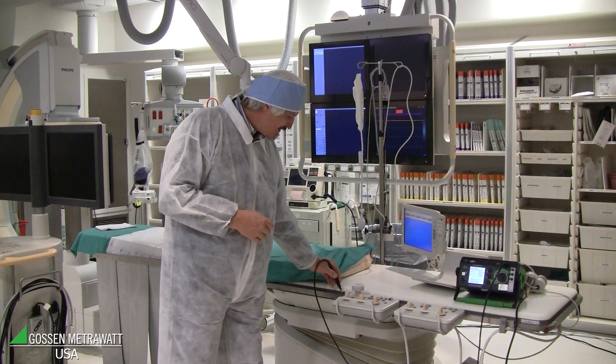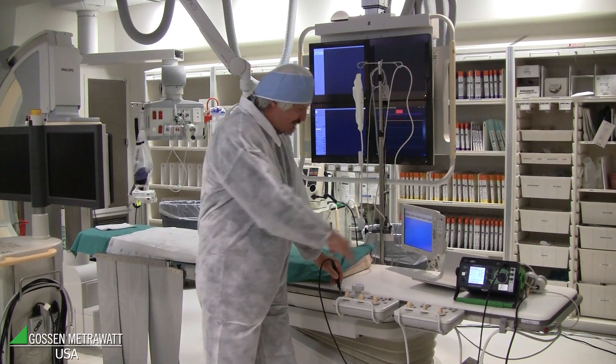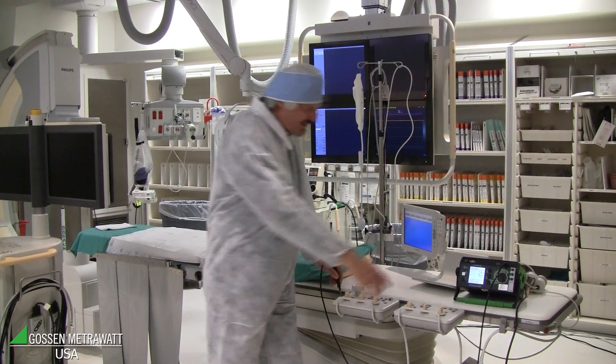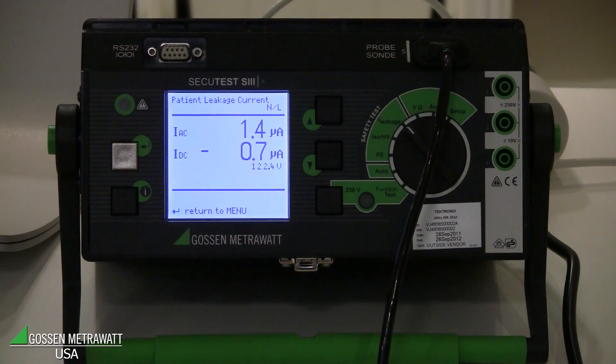Patient leakage current or touch current — for example, this one. I touch the metal, the accessible part, and I can see AC is 1.5 microamps and DC is 0.8 microamps, which is very low, below the limit.